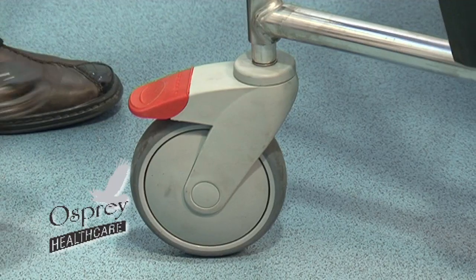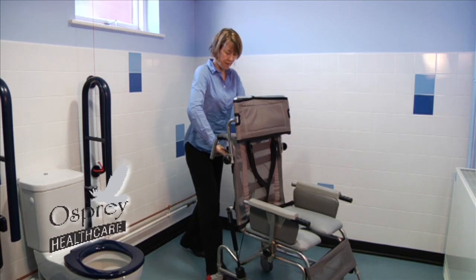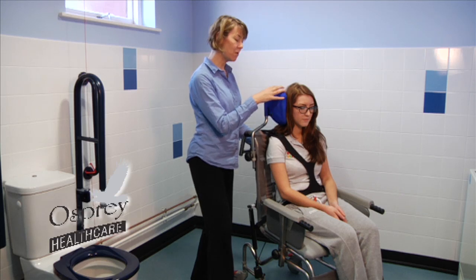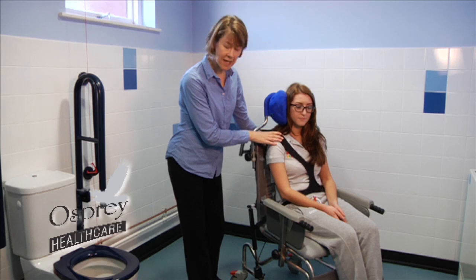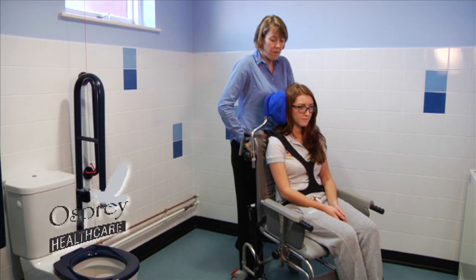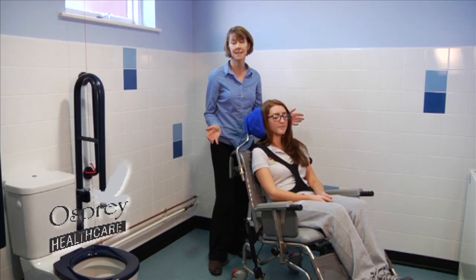To tilt it, we put the brakes on and apply downward pressure to tilt the chair backwards. We've also put on the non-standard headrest — a neoprene moulded headrest — which offers a lot of head support if that's required. She's in her harness, and there's a range of different lap straps and harnesses that can be supplied with this. The brakes go on, and then it's a squeeze of the brake lever and a push down to tilt the person to the angle that you want them to be at, then just release and there they stay.